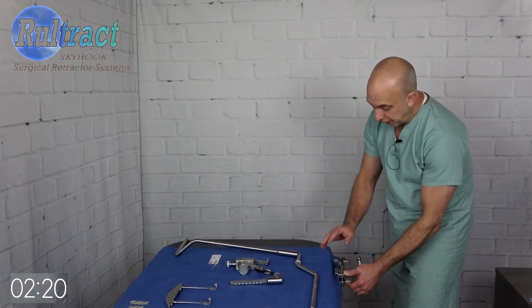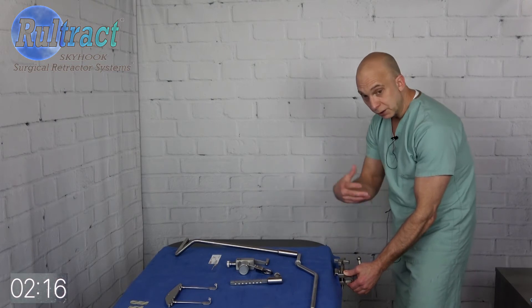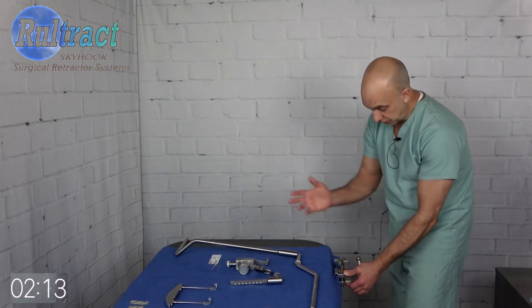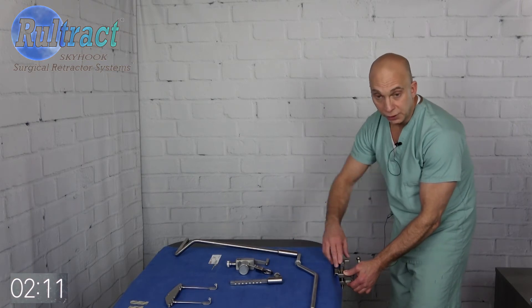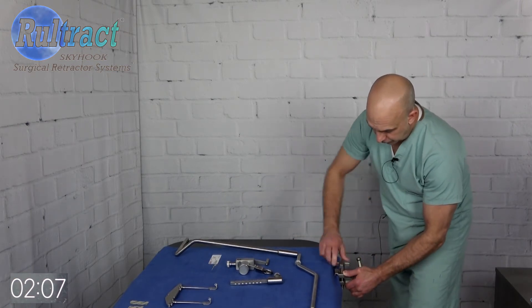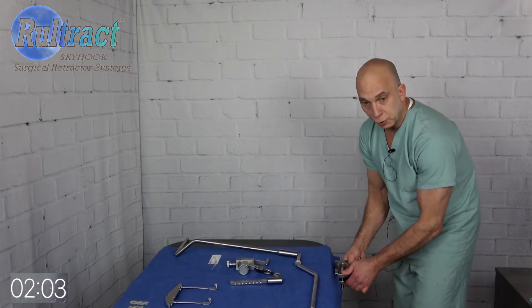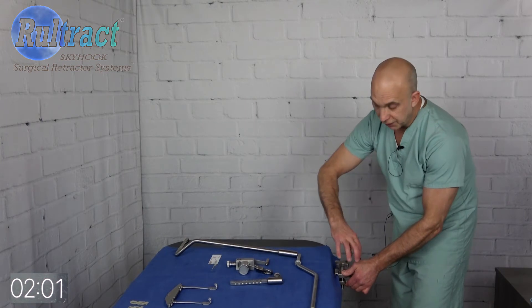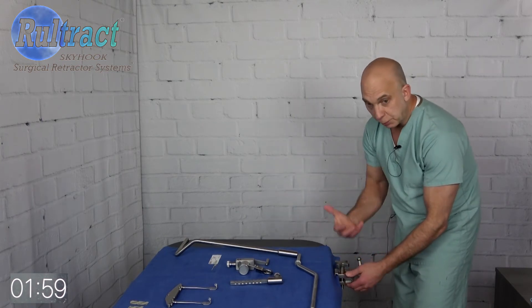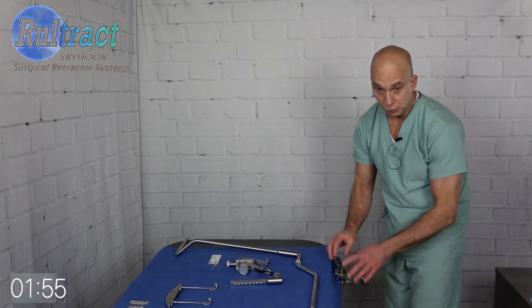I put it on the bed with the tightening knob on the top. You can invert it and put it onto the bed with the tightening knob on the bottom — it works either way. It's called a combination clamp. When I put this on the bed rail I squeeze the jaws closed, hold them closed, and then turn the knob. That gives me a better purchase on the rail, so I would do that with any Ruraltract clamp, but certainly with this one.